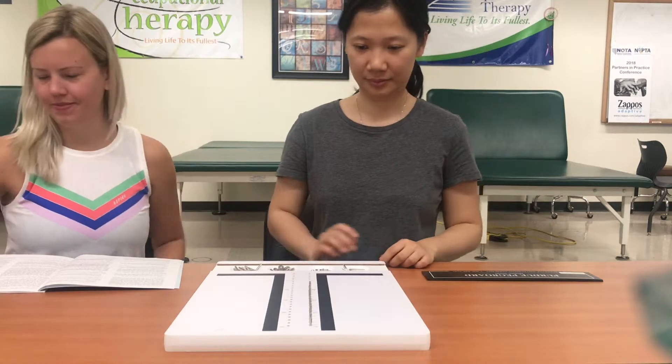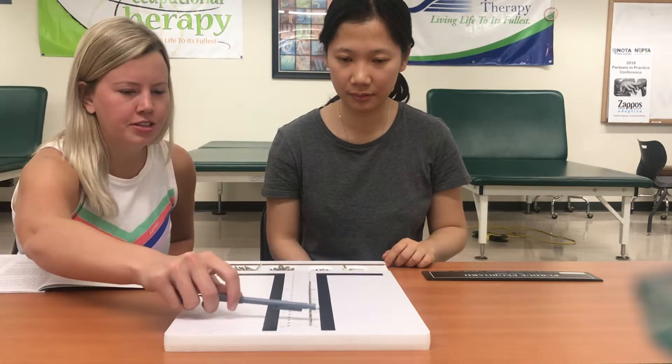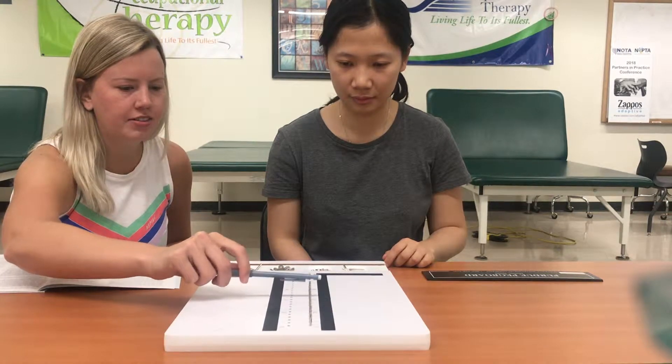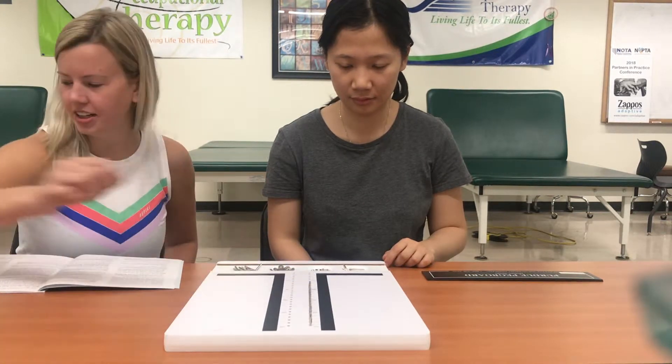Stop. The examiner counts the pins inserted: one, two, three, four, five, six, seven, eight, nine, ten, eleven, twelve, thirteen, fourteen, fifteen.